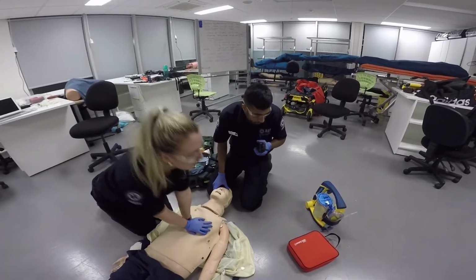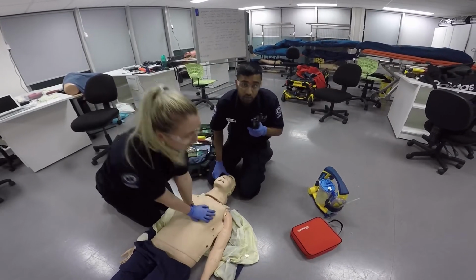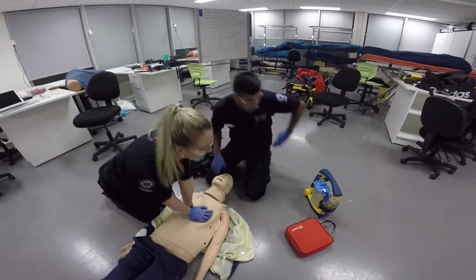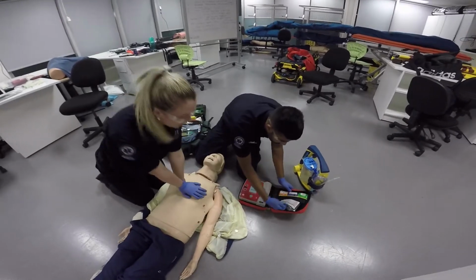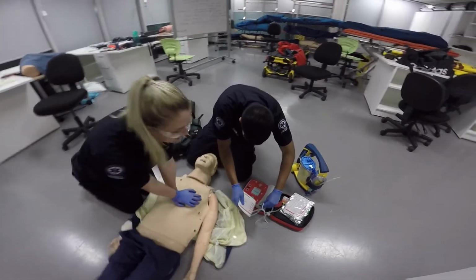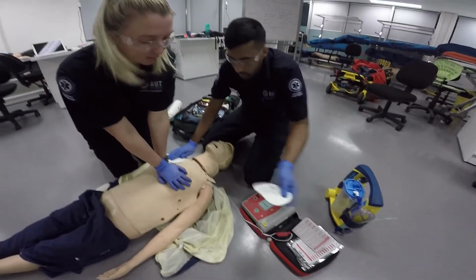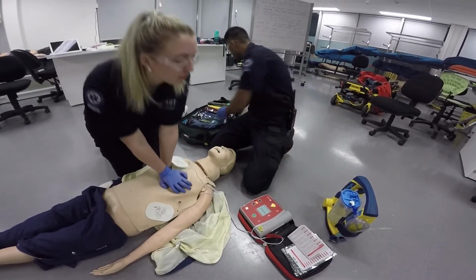AT1 to comms. AT1. Requesting R49 patient. Copy that. Thank you. Alright, so I'm going to start off with the defib for the patient. Placing the pads on him. Shawnee, I'm just going to work around you. Alright, so turn the defib on.